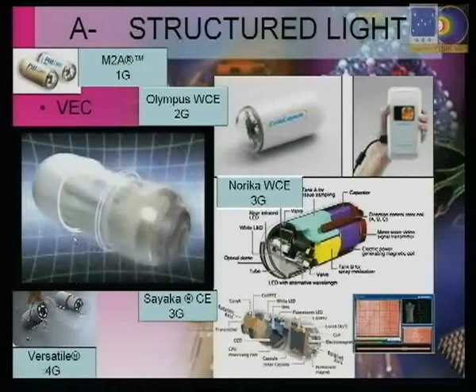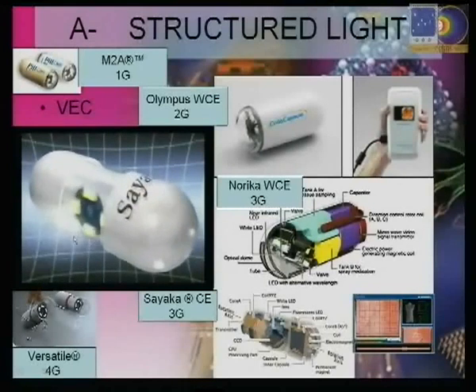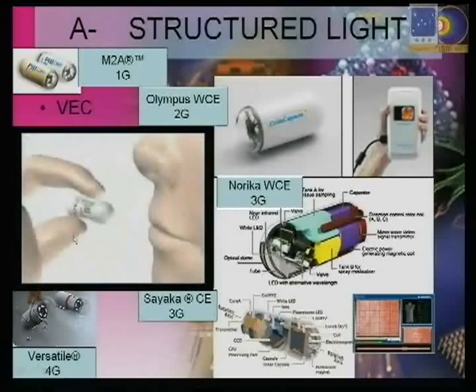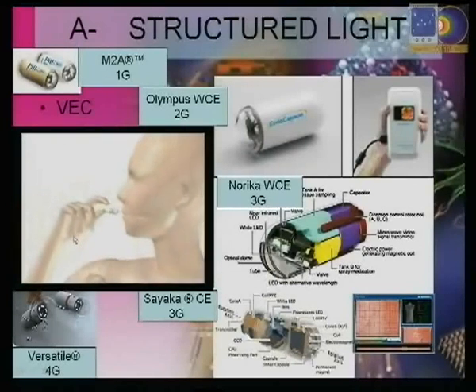This is only useful for the small intestine, because the lumen is relatively small, but in the large intestine the pill moves around and gets lost. If you are lucky you can have some pictures, but probably not of very good quality.